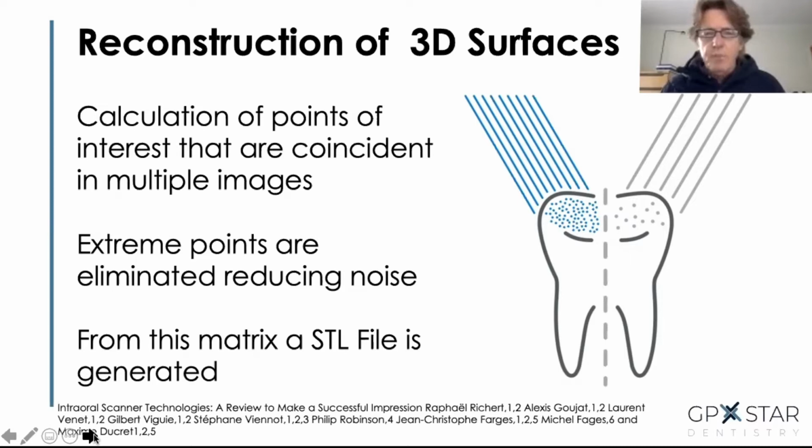So it will help you to generate a nice surface, which is going to be the surface of your prep in the end. As you can see, the camera on the left is a well-known camera that does about 500,000 data points, or almost 1 million data points in fact, per second. And the other one is obviously showing a lesser amount of data points.